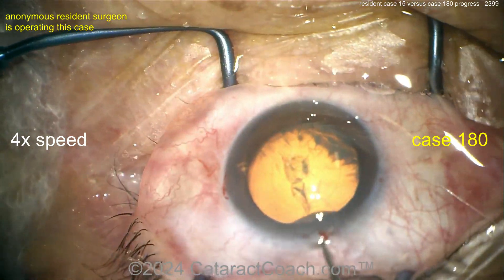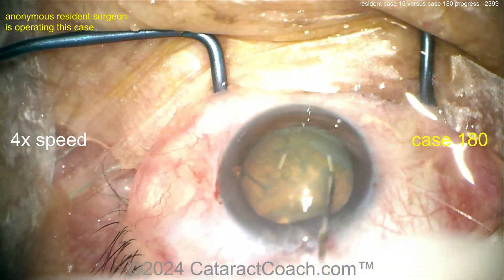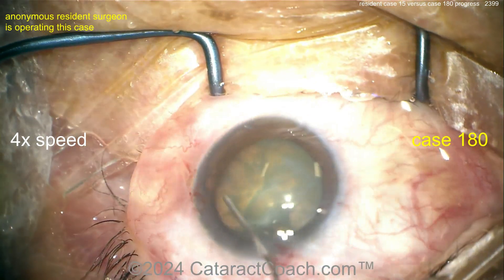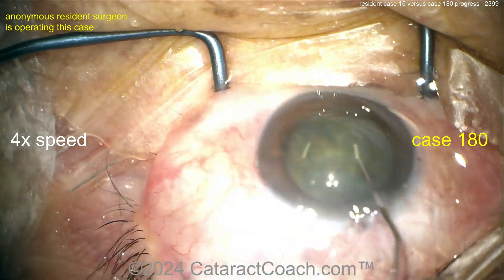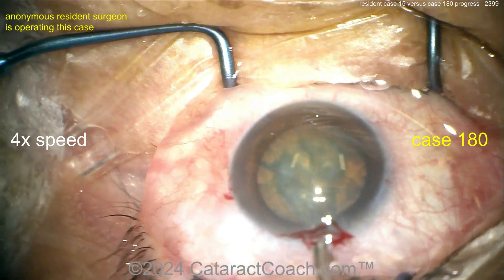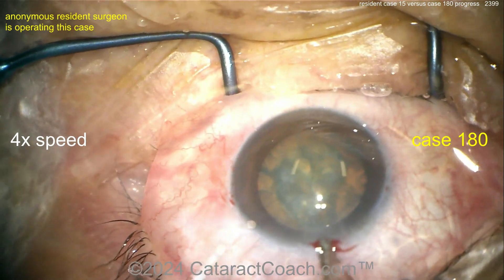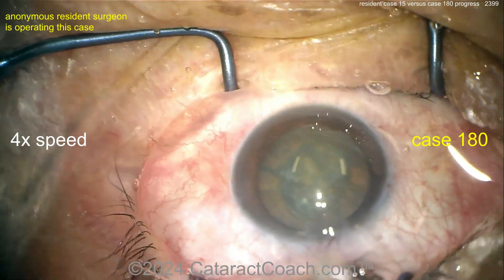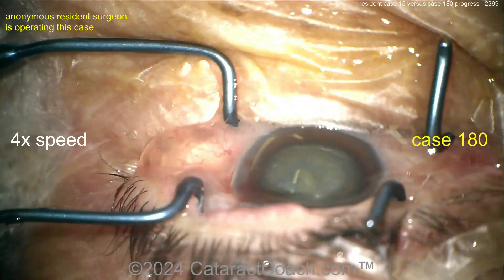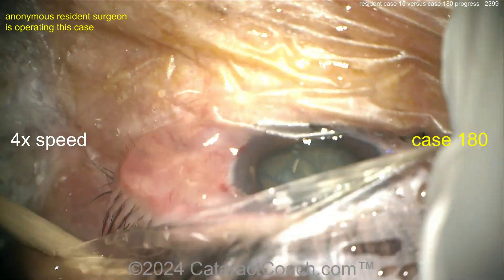You're still making a baby rhexis — you've got to avoid it, there's no upside. The only time I'd recommend a slightly smaller rhexis is if you're worried about a post-op issue. For example, combined phaco-vitrectomy with a gas bubble in the vitreous cavity — then do a 4.5 mm rhexis. Or combined with an Ahmed valve or trabeculectomy phaco-trab — you may shallow the AC post-op and you don't want the IOL to pop out of the back.